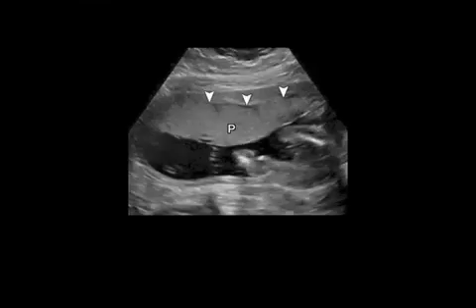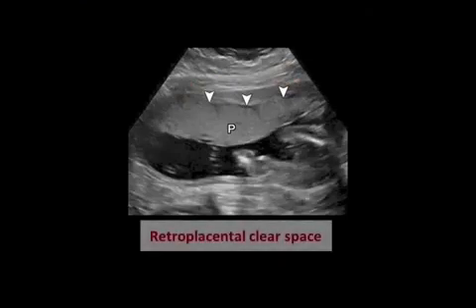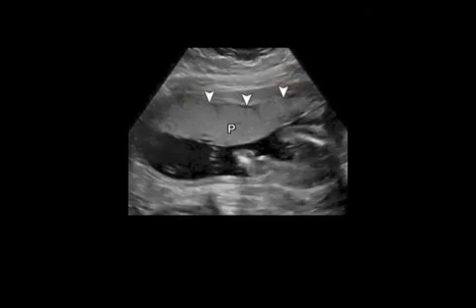The normal placenta on ultrasound appears as a uniformly echogenic structure, along the uterine wall, with a deep hypoechoic band separating it from normal uterine myometrium. This retroplacental hypoechoic band is vital to rule out implantation disorders, and its normal appearance should not be confused with retroplacental hematoma.